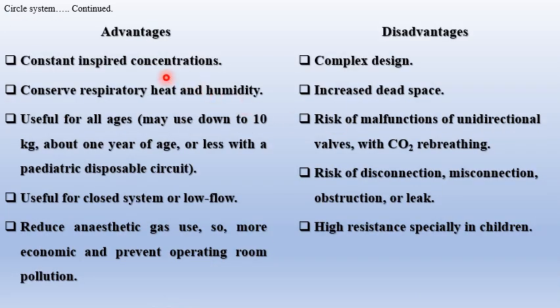Like everything, we have advantages and disadvantages. Regarding advantages of the circle system, constant inspired concentrations. It maintains and guarantees a constant inspired concentration of inhalation anesthetics.